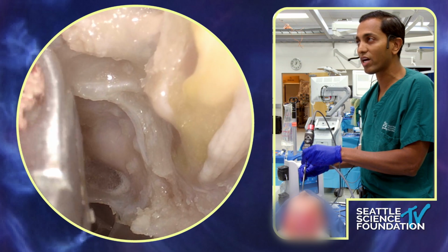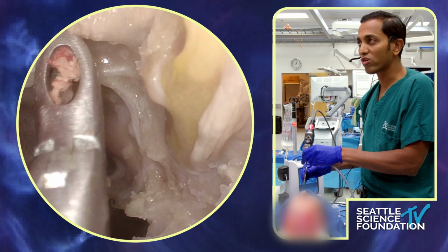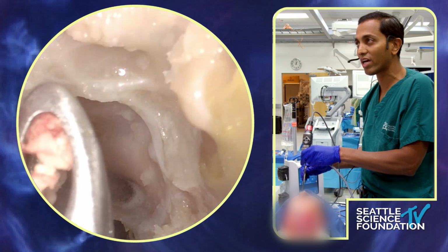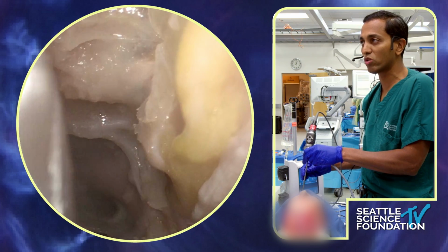We look at, okay, we've got a bony defect. We've got a dural defect. So that's your white there, the dural defect. If you get that, the first thing you're going to do, remember we talked about, is pack it off, think about it, and say, okay, is this something we can fix? We're going to go through all those factors we talked about. And if we can fix it, we're going to go ahead and fix it. And that's what we're going to do today.